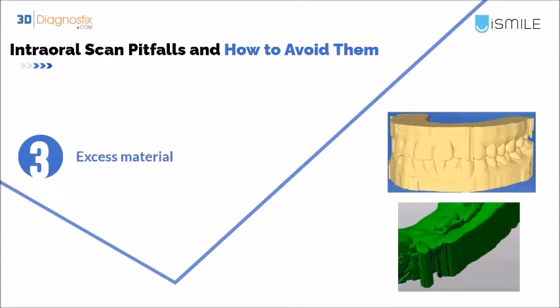Number 3 is the excess material. Actually, this is not an error of an intraoral scanner, because excess materials can be caused due to the fact that we have holes in the scan, which was number 1. Some intraoral scanners can fix the holes by themselves by adding some materials over the holes, and that will lead to an excess material.